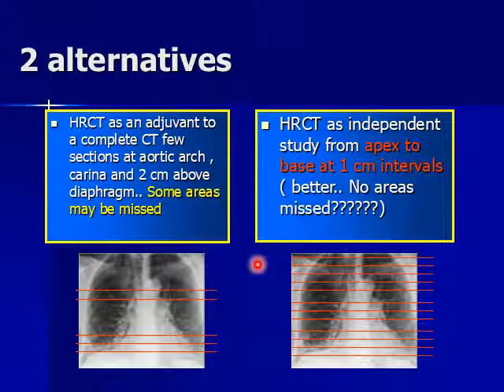There were two techniques in this old-fashioned high-resolution CT. Either we cover the whole lung, and this was the commonest, 1 millimeter thickness, then a gap of about 9 or 10 millimeters, then rescan again 1 millimeter. So there will be an area of about 9 millimeters skipped.